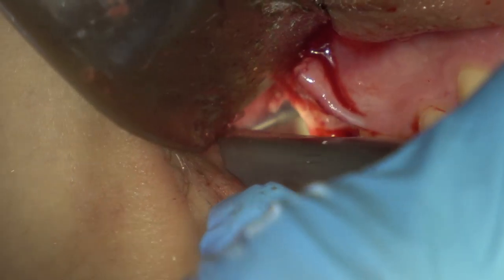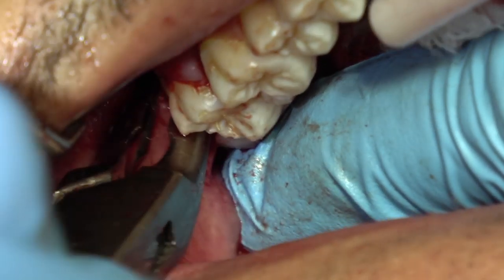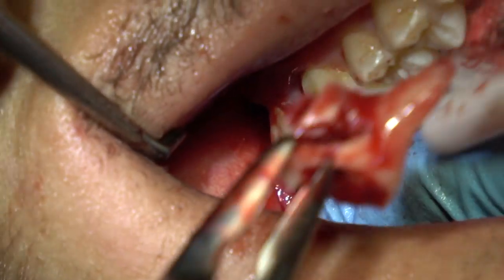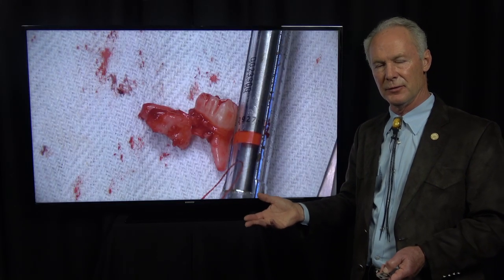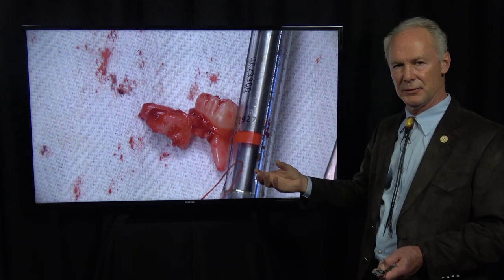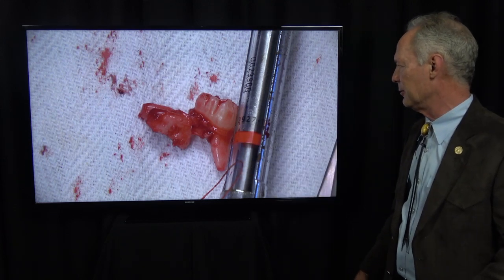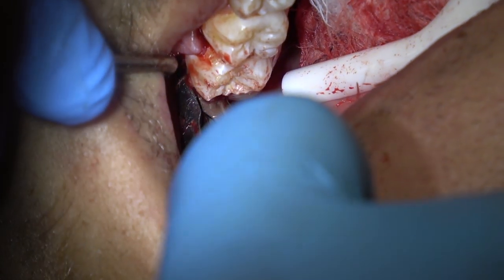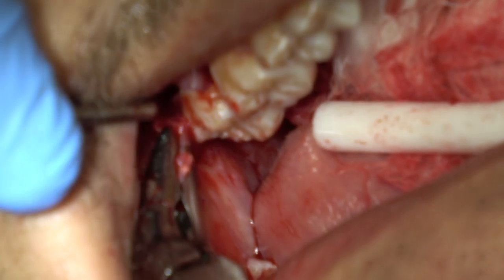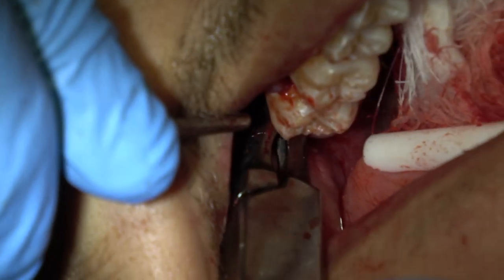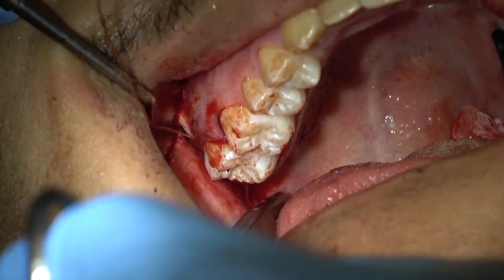In this case it's coming out in pieces — drilling another hole in the remaining part and it elevates right out. Upper wisdom teeth with fully formed roots are more difficult to remove than a tooth with just a quarter-formed root, so you'd really like to get to them before the root is this formed — especially maxillary wisdom teeth, because those roots tend to fan out and it creates a larger extraction site. I'm removing that follicular sac and placing one 3-0 suture in the maxillary extraction site to close the flap.